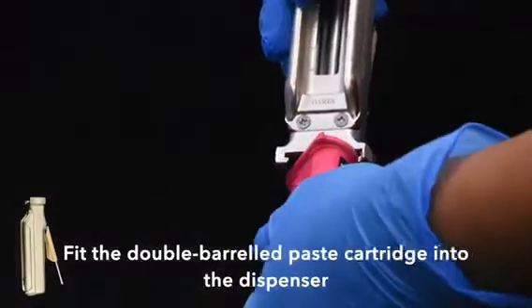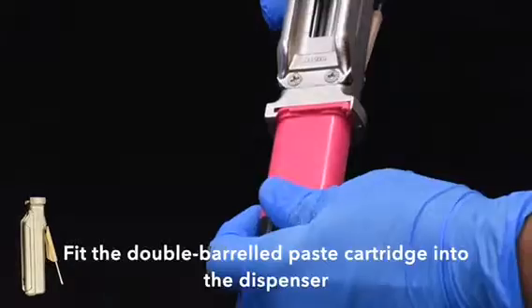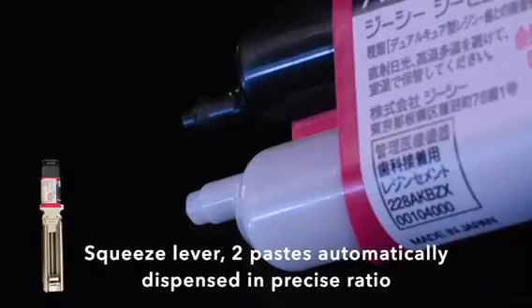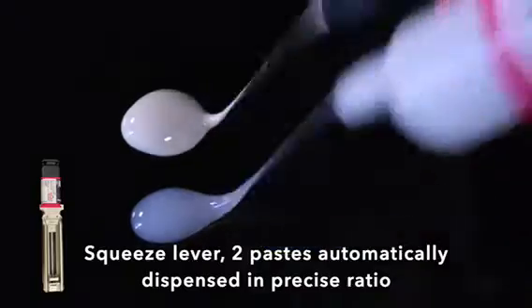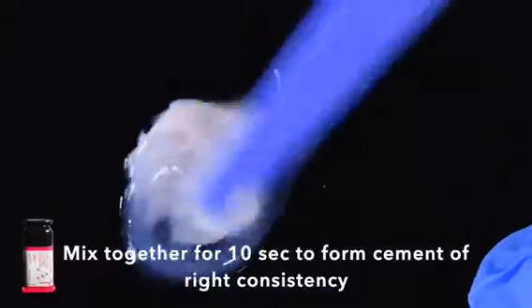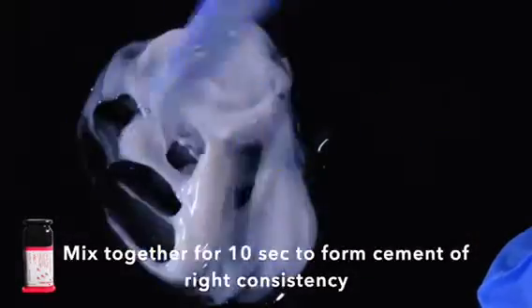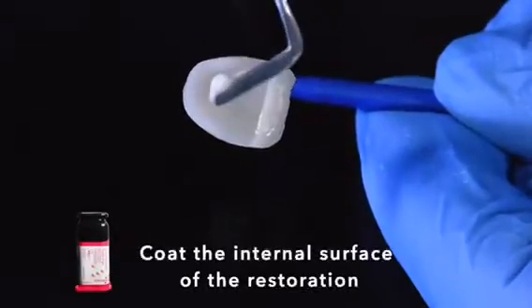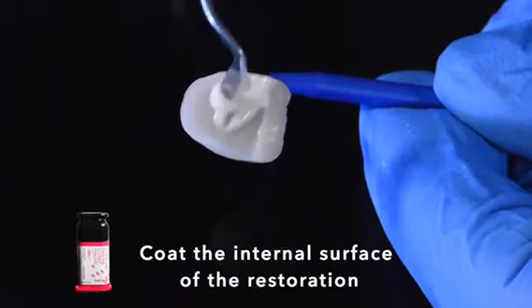Fit the cartridge into the dispenser. Squeeze out the cement and mix together for 10 seconds until it's even. Coat the internal surface of the veneer with the cement.